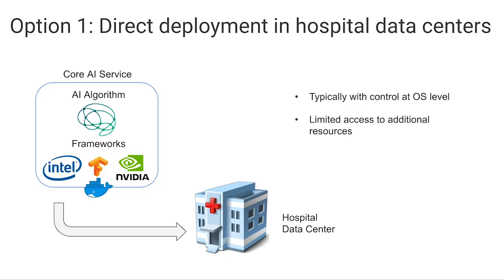So the traditional, most conventional way to deploy these apps to hospitals is to use hospitals' data centers and existing IT infrastructure. Typically, the way to do that is you are given access to a virtual machine and you have control at the operating system level.